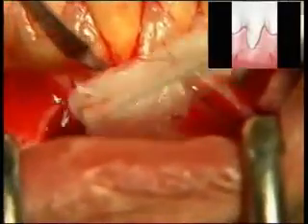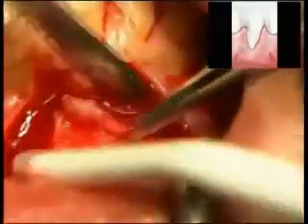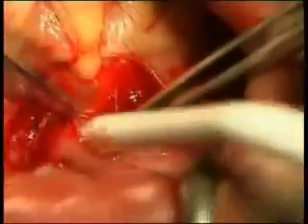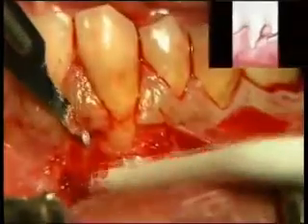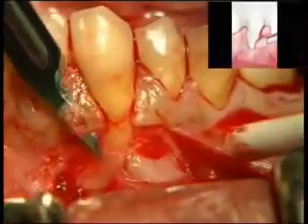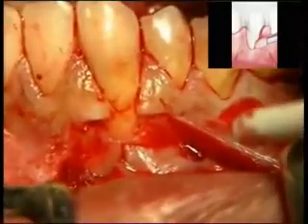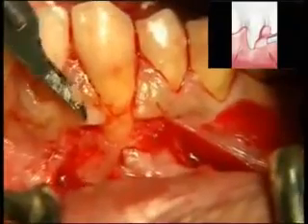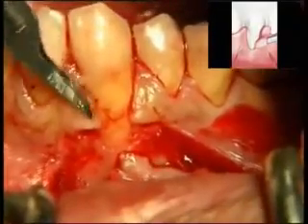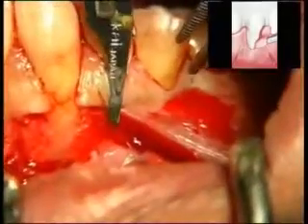Using a CTGO and rotating movements, and subsequently using a Pritchard, a full thickness flap is raised for about 4–5 mm. The residual papillae are disepithelialised, firstly using a 15C blade with a long external bevel, both on the mesial and the distal aspect.